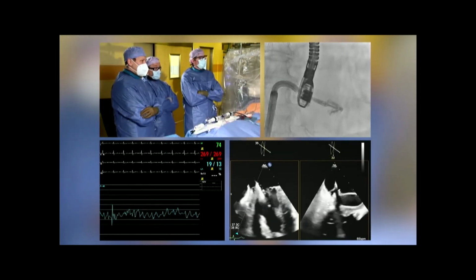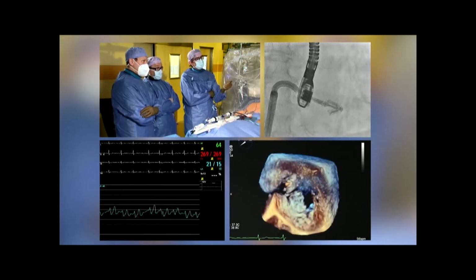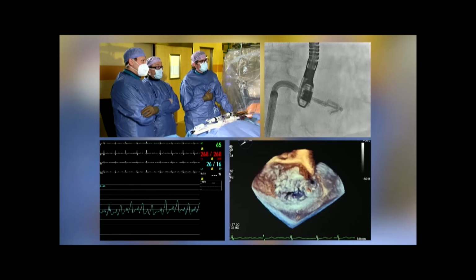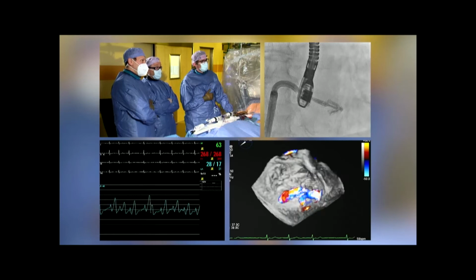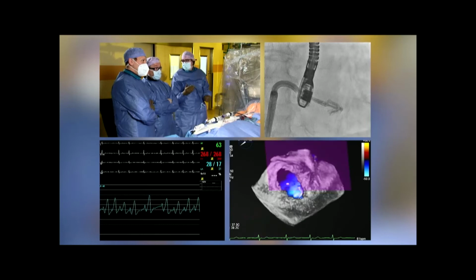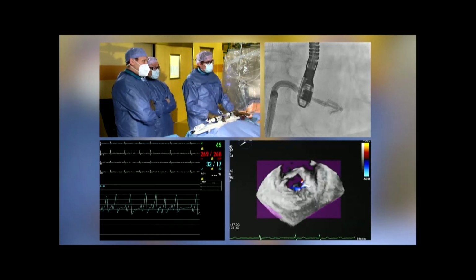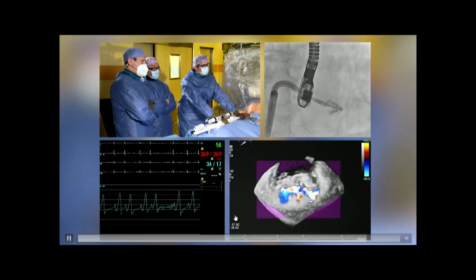Okay, so what's important now? To make sure that we don't have MR left medially. The clocking is better now? Yeah, clocking is better, and I think if you can have the color Doppler flow on this 3D, we can nicely appreciate the jets, okay. There's still two tiny jets. It might be more laterally now because we went more medially, but that's fine because I'd like to place another one there anyway. I just cut down the plane just to be sure where the color flow is coming from, and it seems that it's really all laterally.